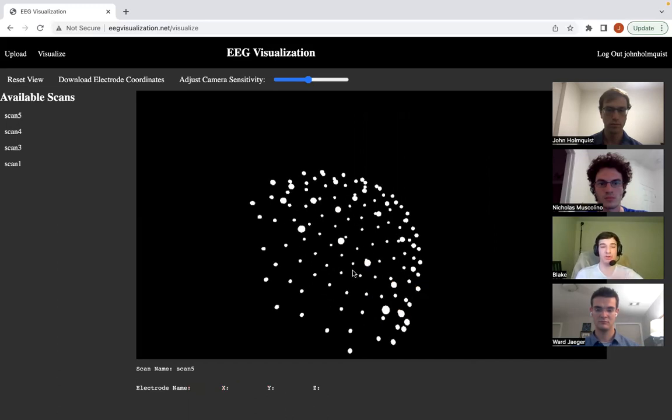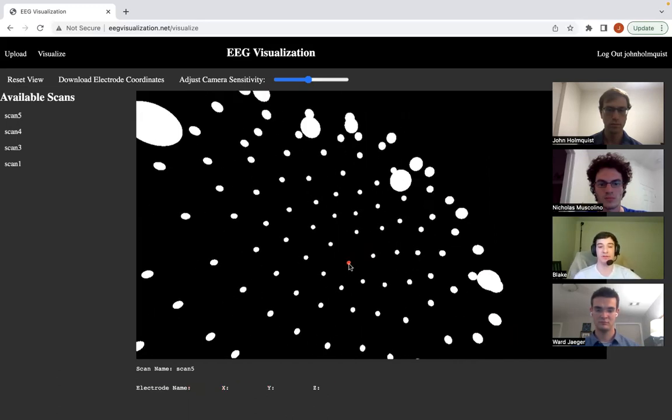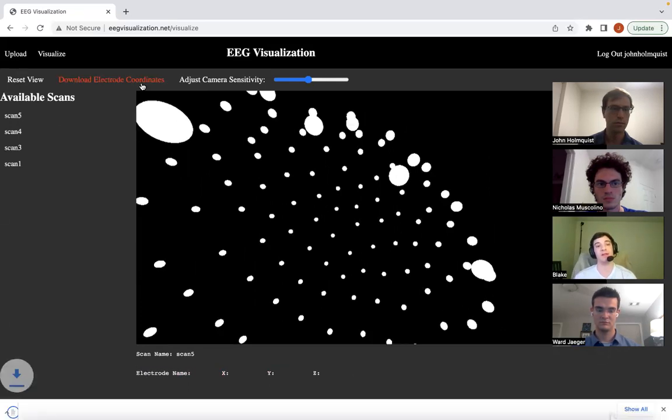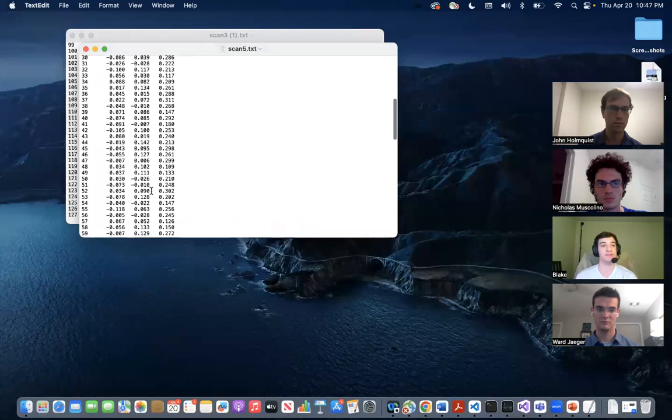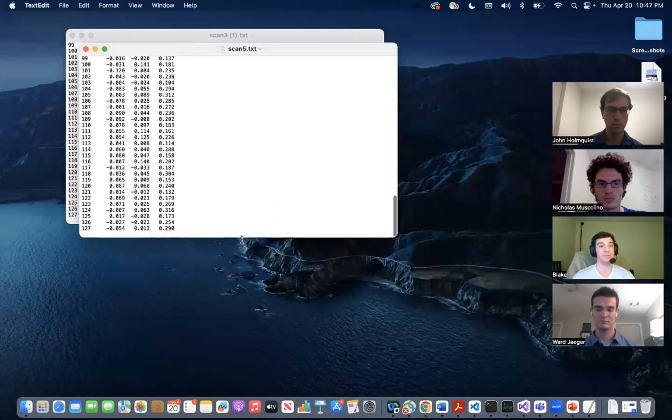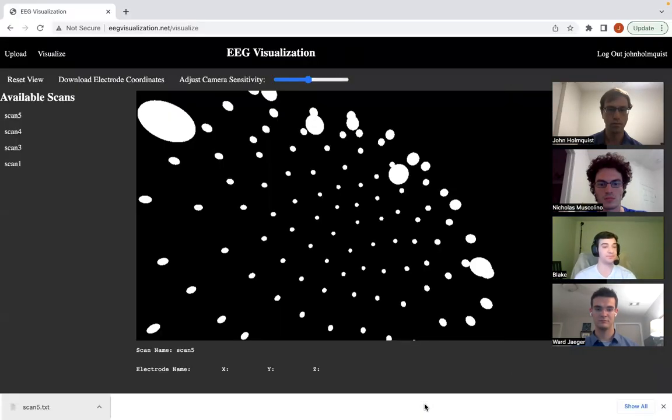But if you want all of the data instead of selecting one node at a time, which was one of our requirements, you can go up to the download electrode coordinates button at the top, and that'll just download a TXT file for you with all the data organized with the electrode name and their position variables.